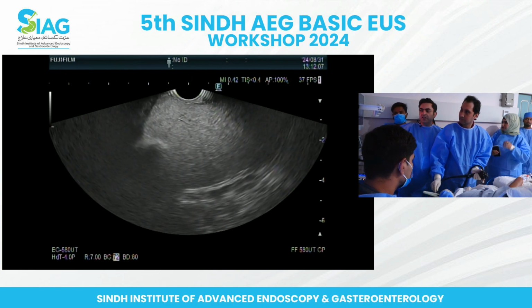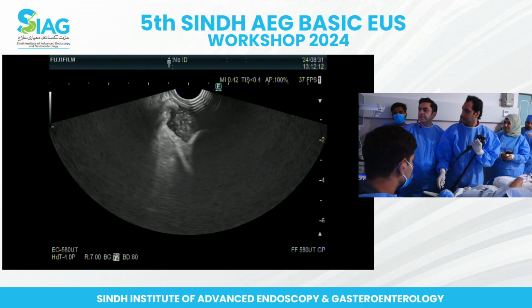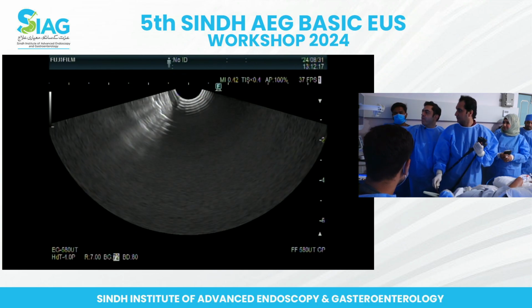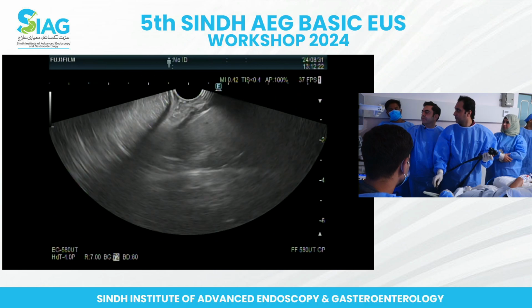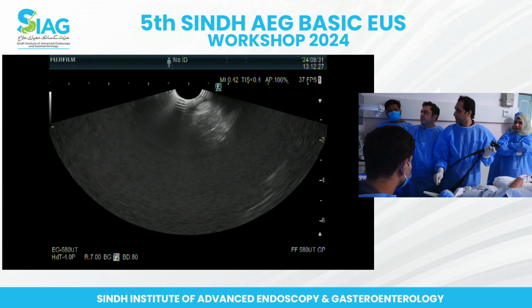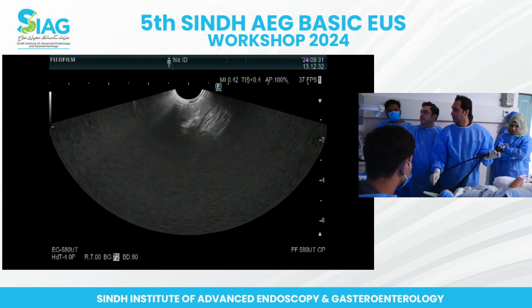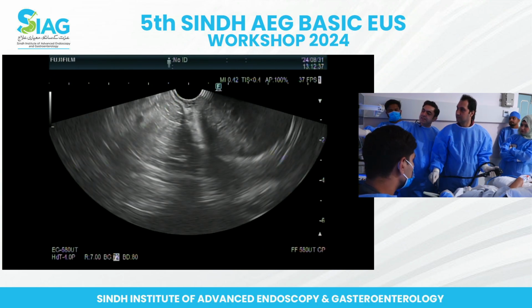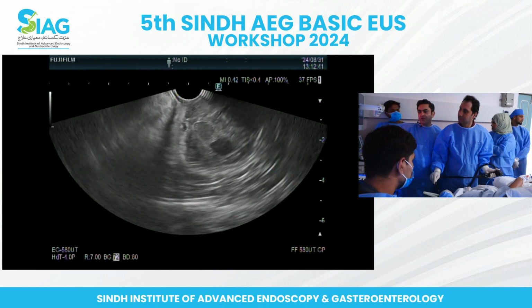Okay, should we go to the lesion now? Yeah. Just bring back. We couldn't figure out the pointer here. Can you see the lesion endoscopically? It was in the fundus somewhere, wasn't it? It's 5 centimeters, so you can't miss it. There's the one. Excellent. So let's just have a look at that. Try to bring it in the center. It's on the right of the screen, so you can pull the scope back, and it will come in the center.